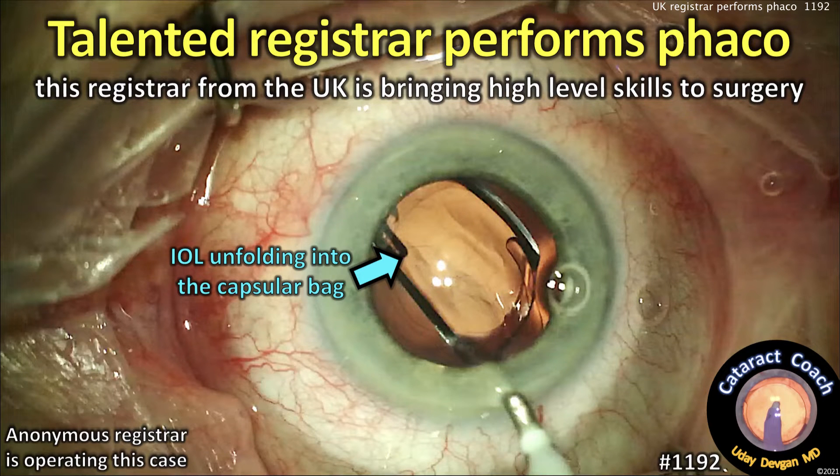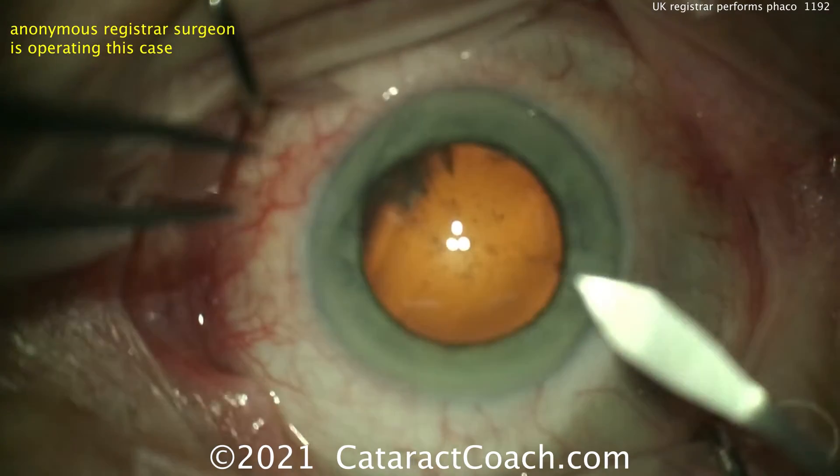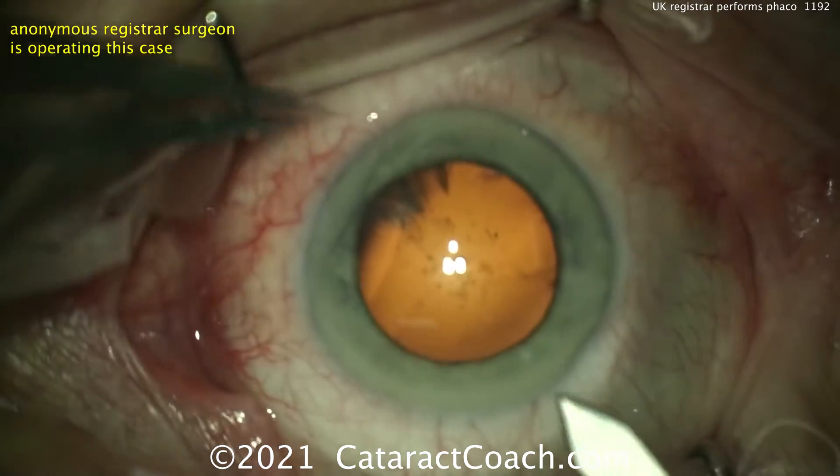CataractCoach.com. A talented registrar performs PHACO. This young doctor from the UK is bringing very high-level skills to surgery. This is a nice case to watch. I'm going to show you the whole case unedited — only about 8 minutes.